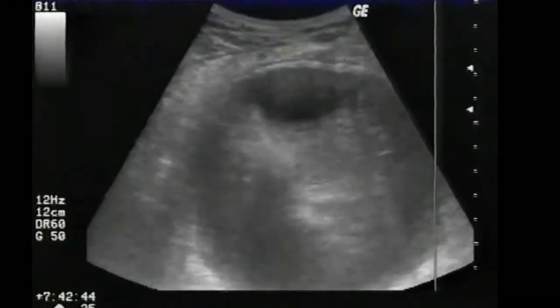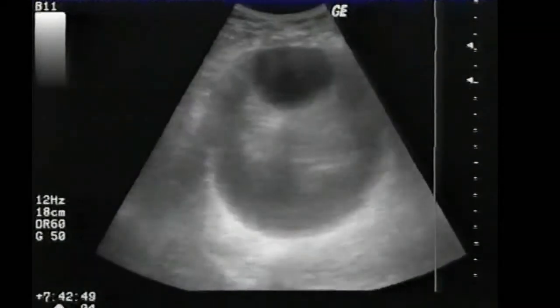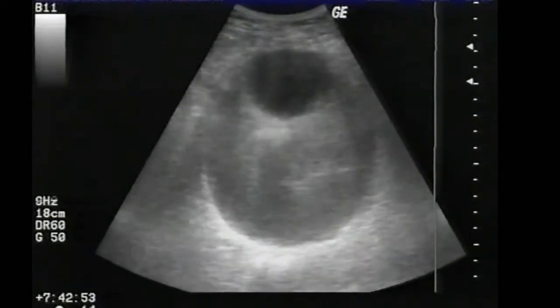Okay? This is an oldie but a goodie, by the way, from North Shore back in the day. 8 centimeter AAA, went right to the OR. It's my case zero, so I always play it when I can.